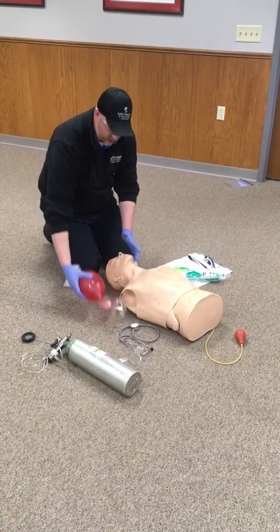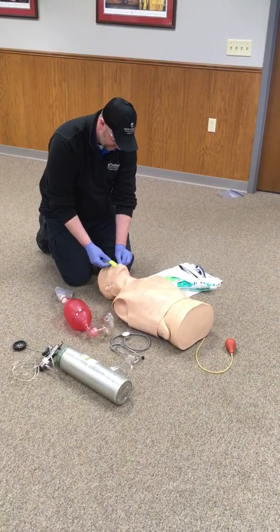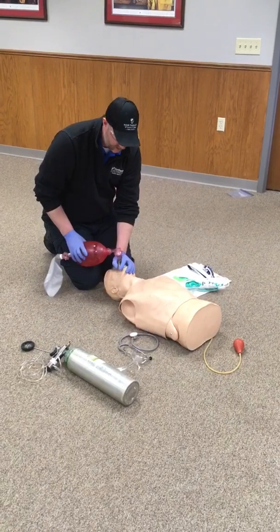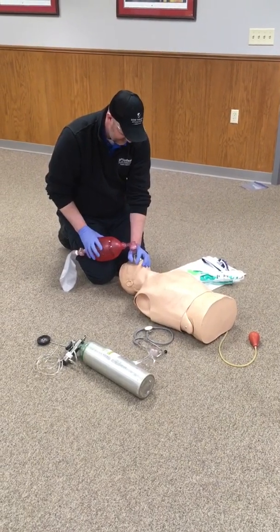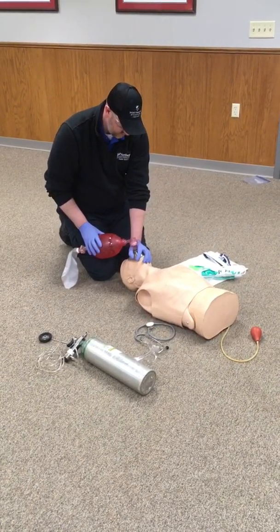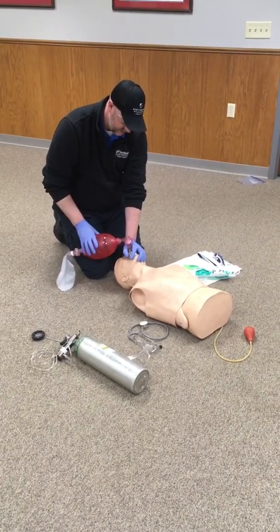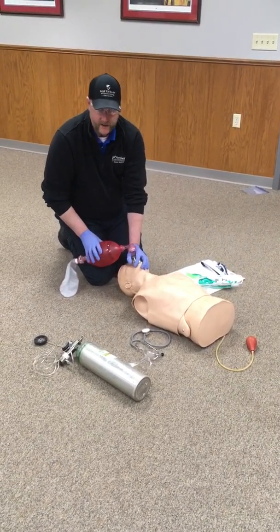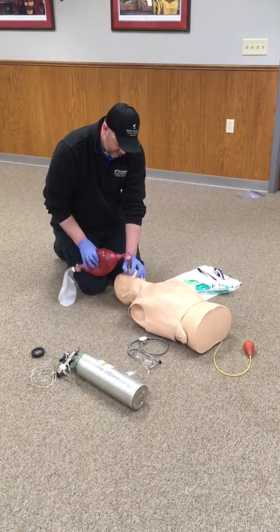We look for that chest rise. Once we know that we have an open airway, we're going to go ahead and measure and insert our oral airway. The examiner will tell you that your patient accepts the oral airway and does not have a gag reflex. So now we're going to bag our patient one breath every five to six seconds. While you're ventilating the patient, the examiner, after about 30 seconds, is going to tell you that your ventilations are being performed without difficulty.